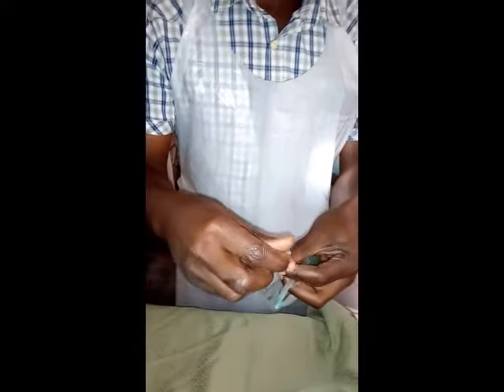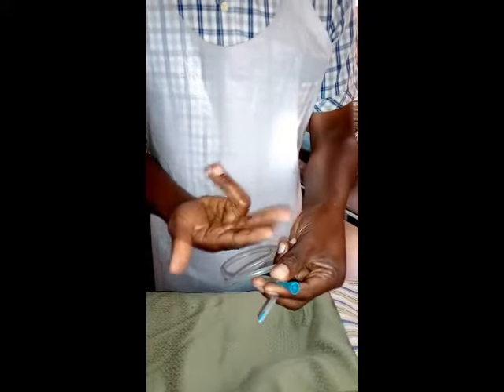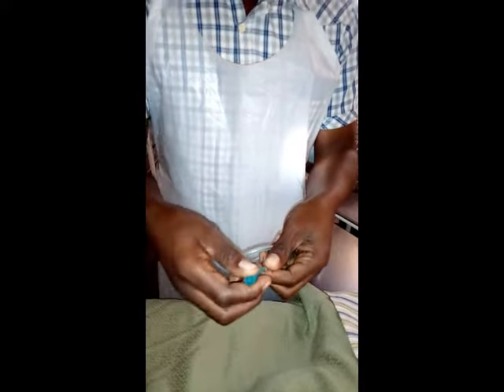This is what we call a spigot. It's simply a stopper. A spigot has to be put there so that air does not go in, or dirt or anything. So you have to close it up. So this is a spigot.